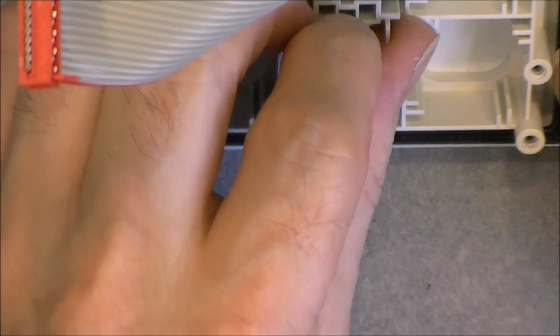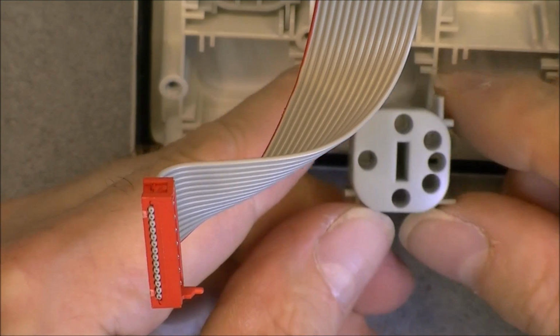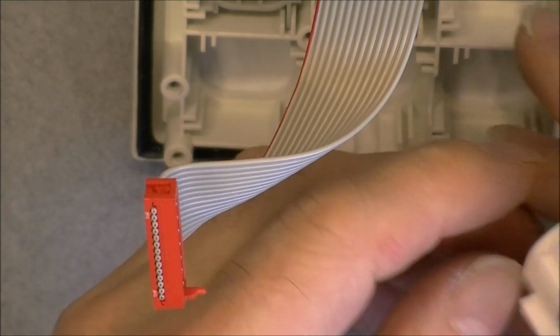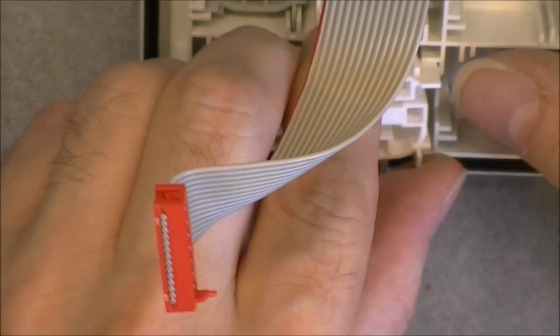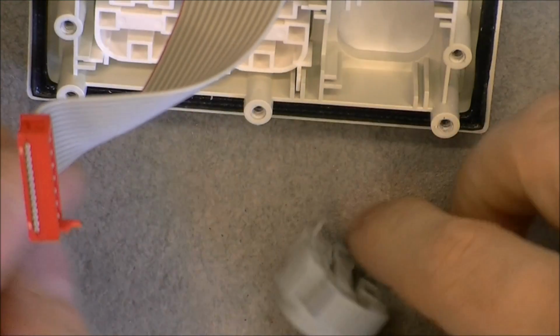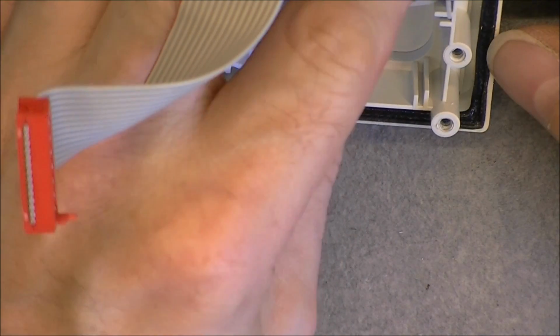Yes, the holes. In fact, you cannot put them... No, you can totally put them the wrong way. And in fact, you have holes to let the light from the LEDs shine through anyway. Quite interesting. You can see there are holes for a number of configurations of LEDs. Of course, I did put one in the wrong way.